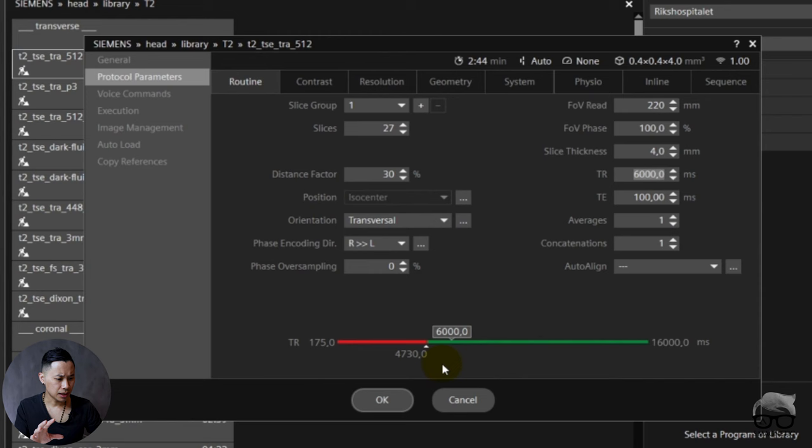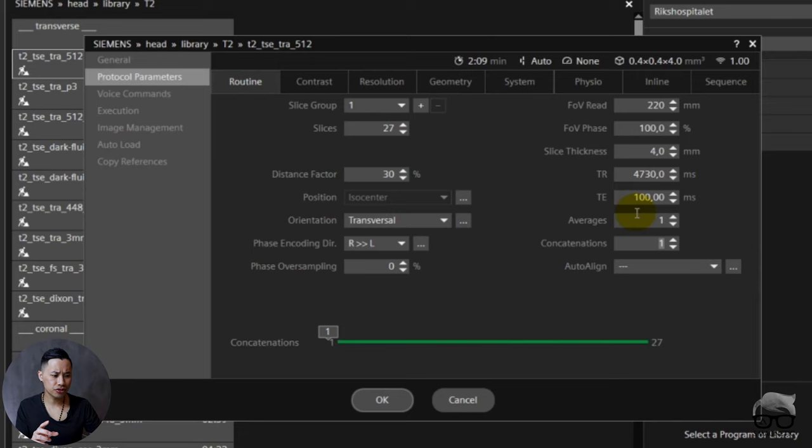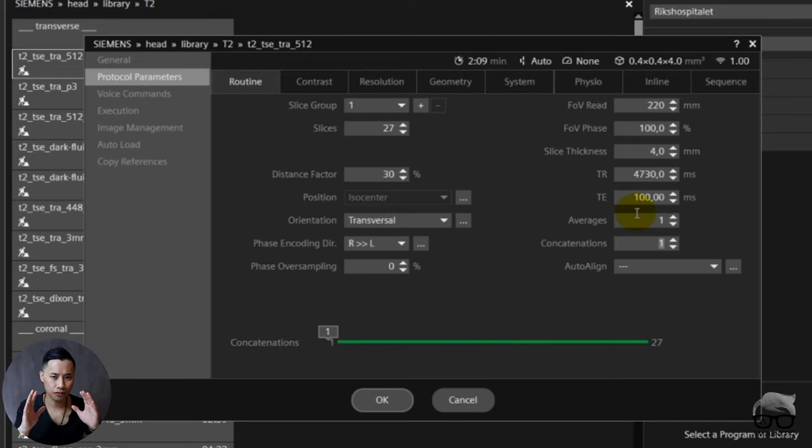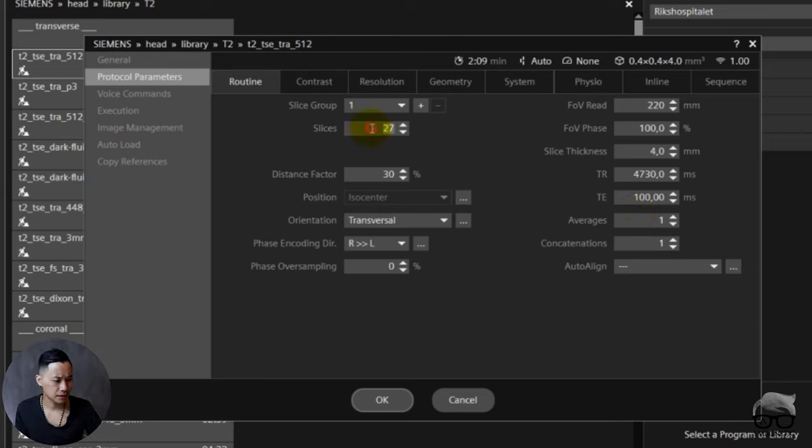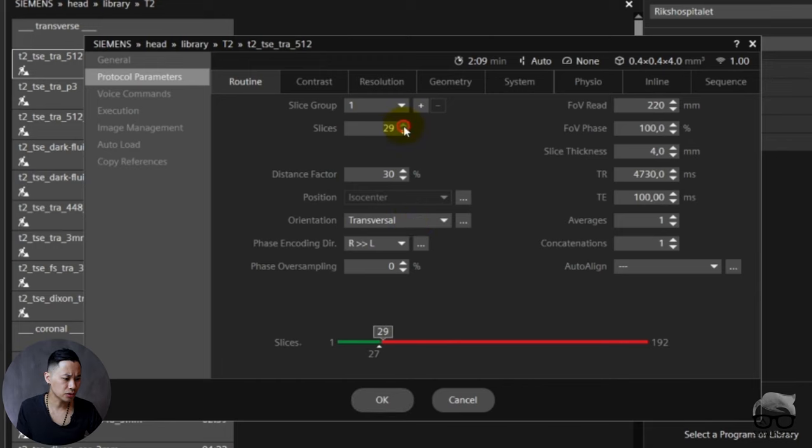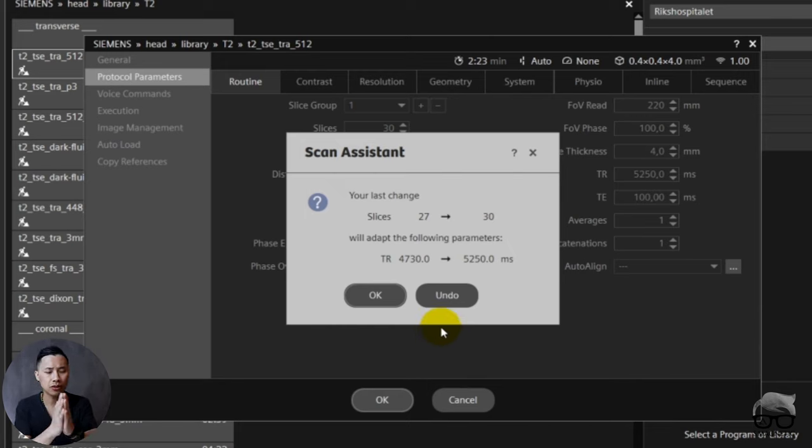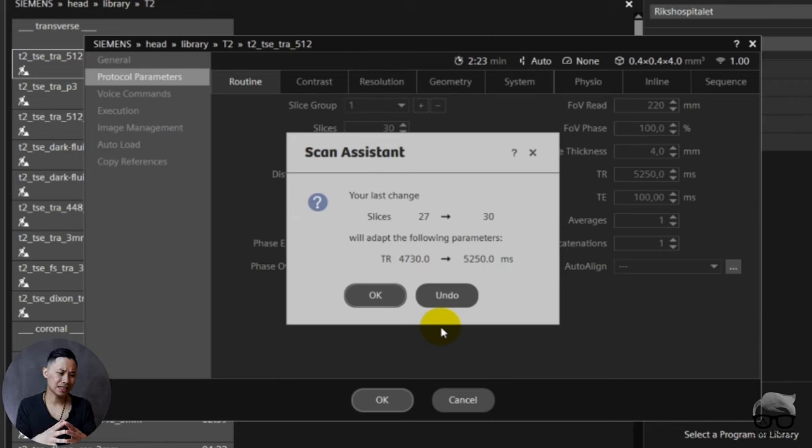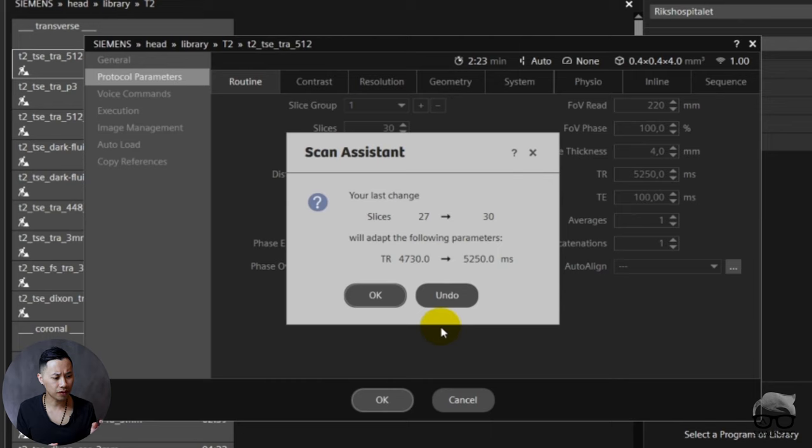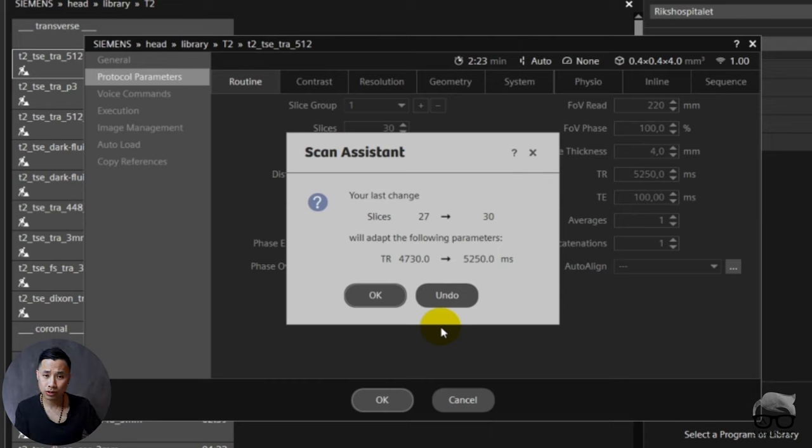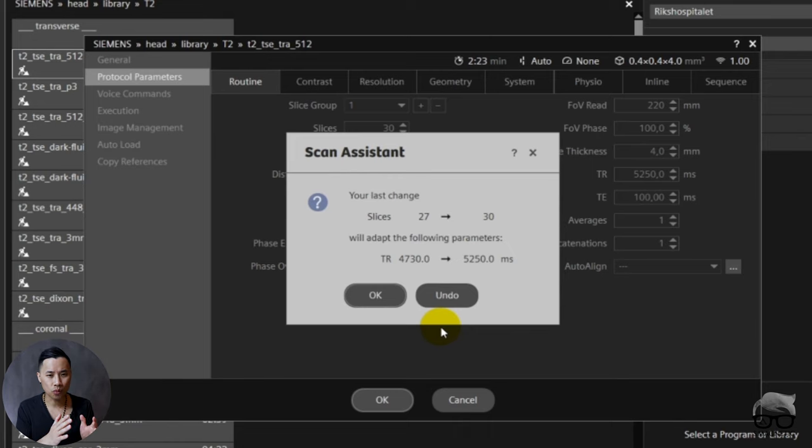In practice you have now, let's say I choose 4730, which means now I only have room for 27 slices. You can see it's maxed out at 27 slices. Let's say I want to add up to 30 slices. So I push the up button. Look, now for me being able to go from 27 slices to 30 slices, the scanner says hey, you need to increase the TR for being able to do so, going from 4700 to now 5250.